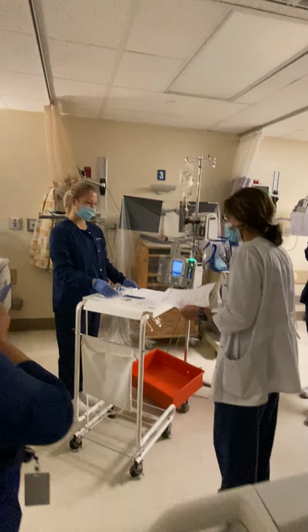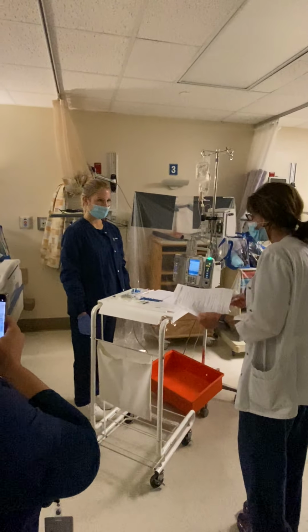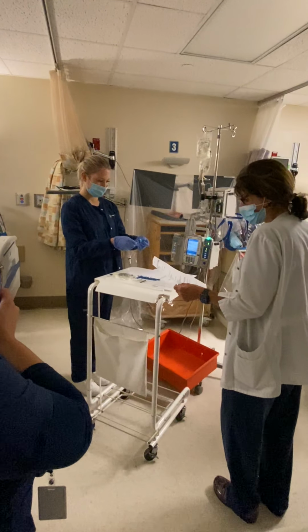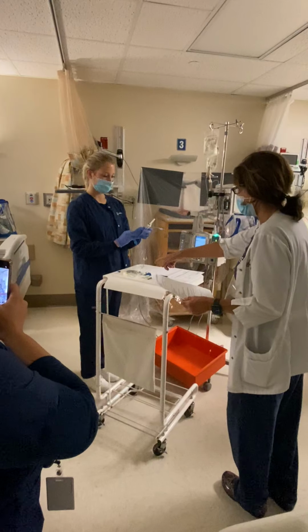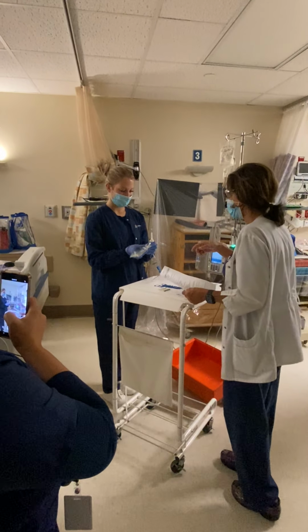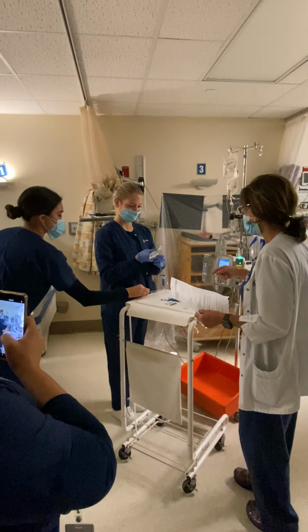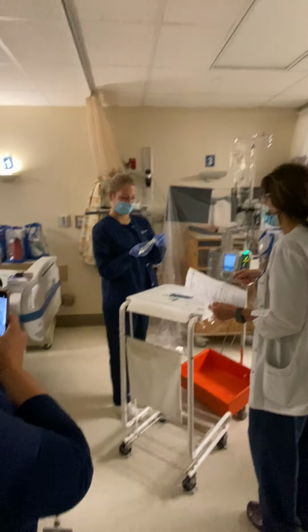You've checked now your 2nd right, so now you're actually gonna perform your skill. Okay, so what you're gonna do first is you have your new tubing. You want to make sure it's clamped. Okay. And you're actually going to attach your bag. So you can pull that out, and make sure you pull that off, and you don't want to contaminate it. And save all your little pieces. That's okay. I'm gonna hold these for you. Okay.